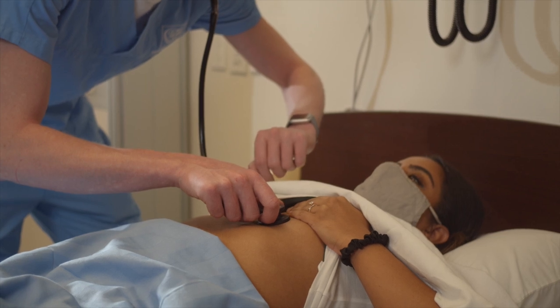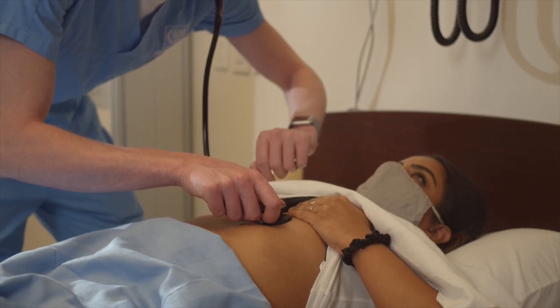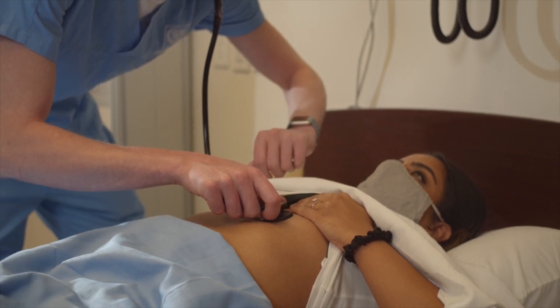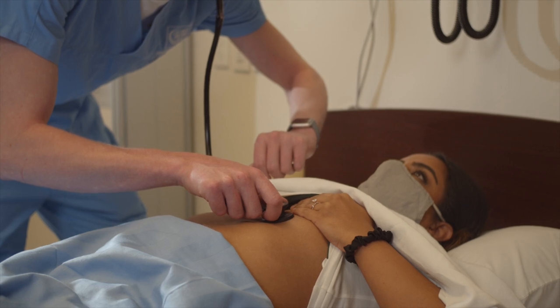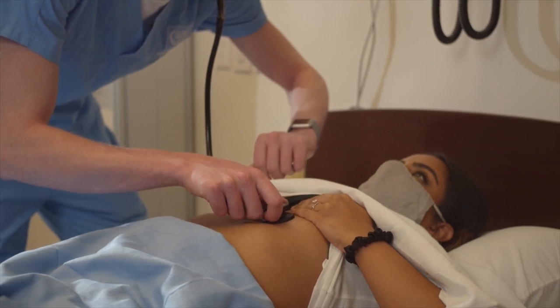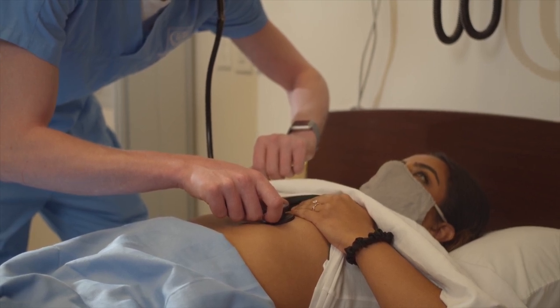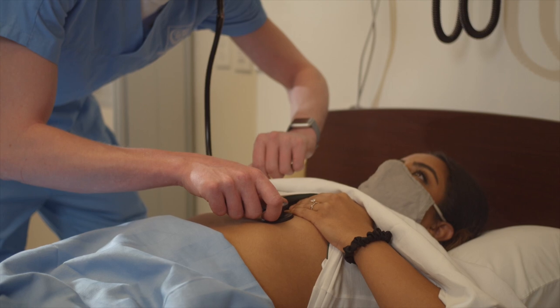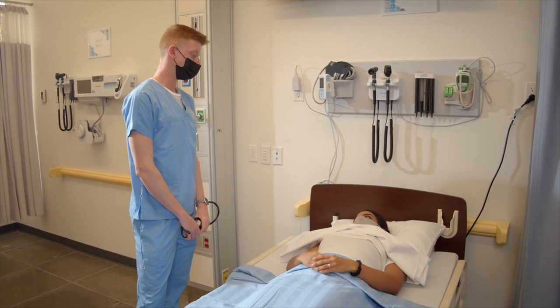I'm going to do a second. I'm just going to put my stethoscope on your chest. Thank you. So your heart rate is 82 beats per minute and the rhythm is regular.